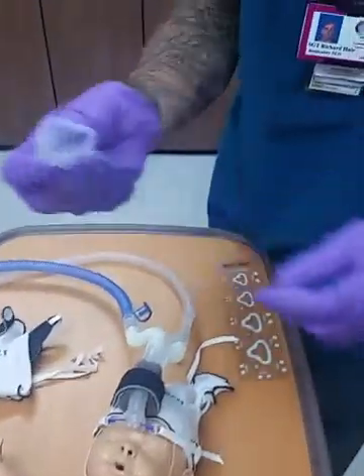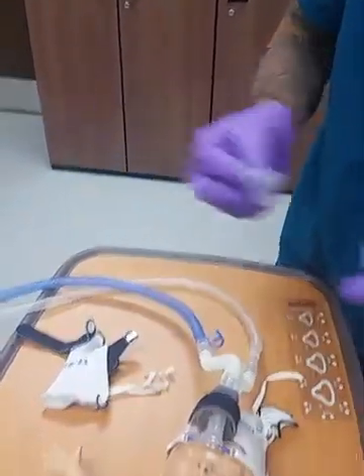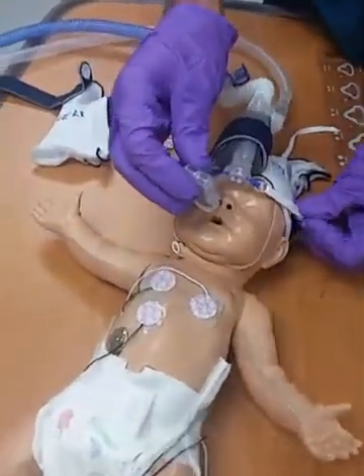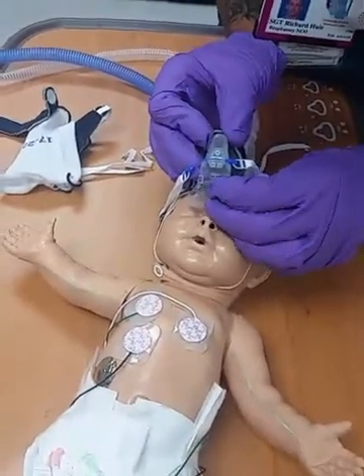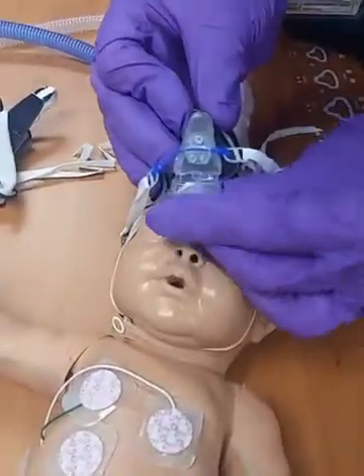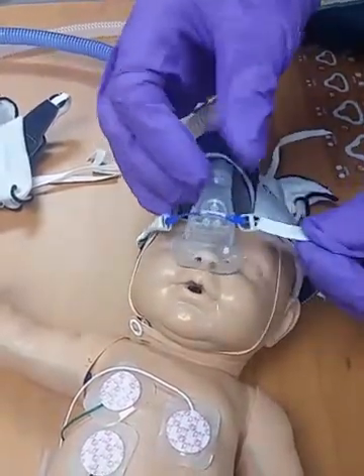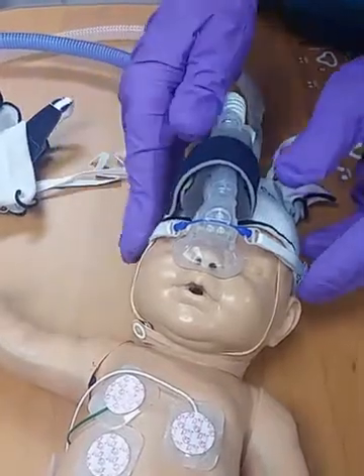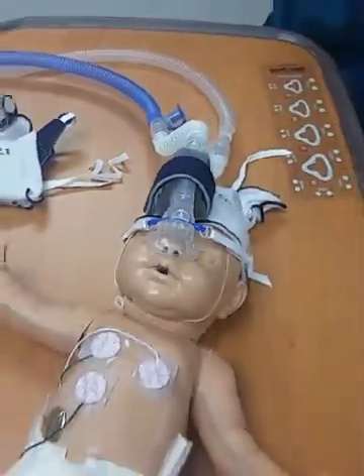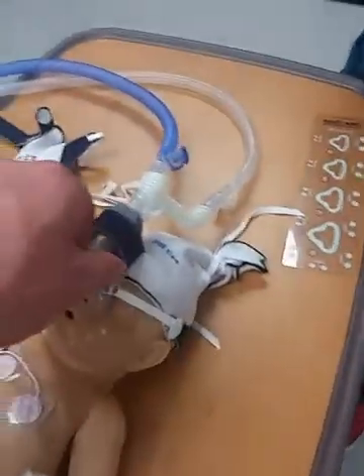So now you can either use this full face mask, full nose mask, or you can use prongs. We're gonna use the nasal mask here. You hook it up right here at the end of the flexi trunk, then slip it over the nose. Make sure it's tight enough so where you have the bubbling. We don't have any bubbling here because the baby is anatomically incorrect.